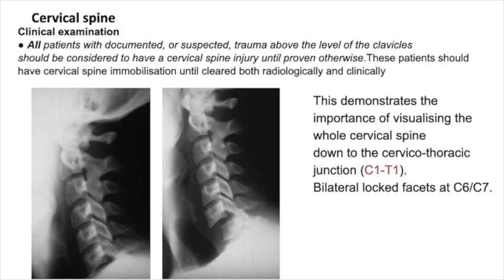That's how important it is to take a proper cervical X-ray, and you also have to know the quality of the cervical X-ray. To have a good quality, you have to see from C1 to T1, from C1 to T1. In that case you avoid any misunderstanding or misdiagnosis of the patient. It's very important to know that.